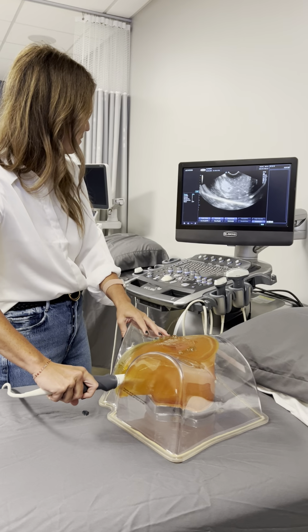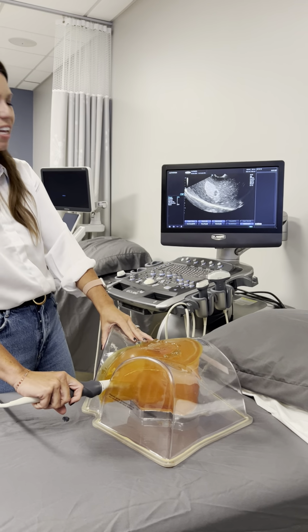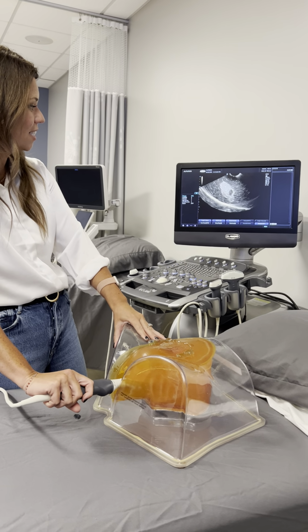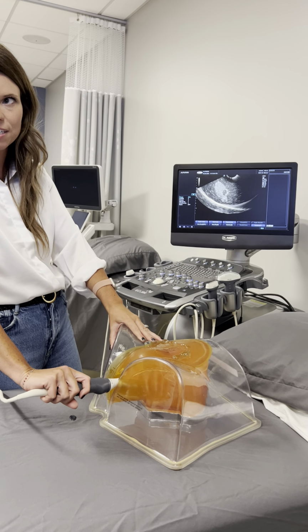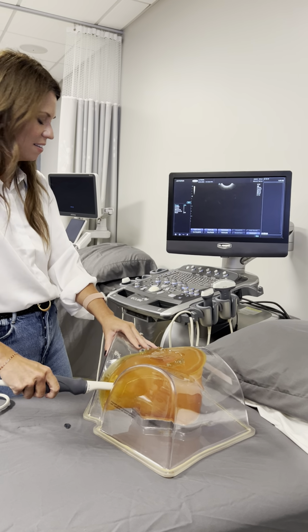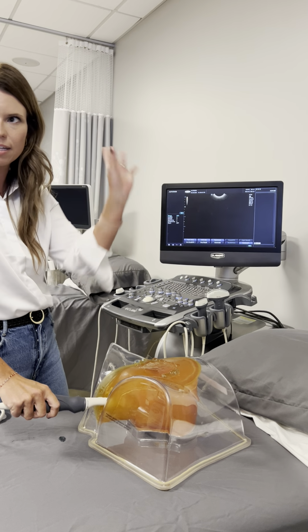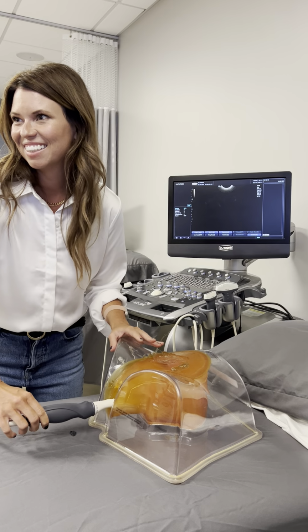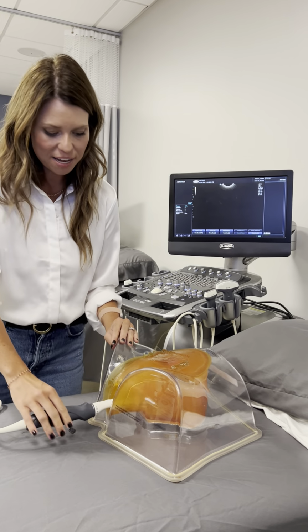If I can see her ovaries, there she is. That's how much better the ovary looks. So much better, so much clearer. We can really see it. We can really evaluate it. We can look for follicles if we need to. We can do everything we need. And then, I don't know, she's too broken to see her left ovary, but it's there. We looked at it transabdominally. Any questions? A little bit better? Makes a little bit more sense? Okay, awesome.